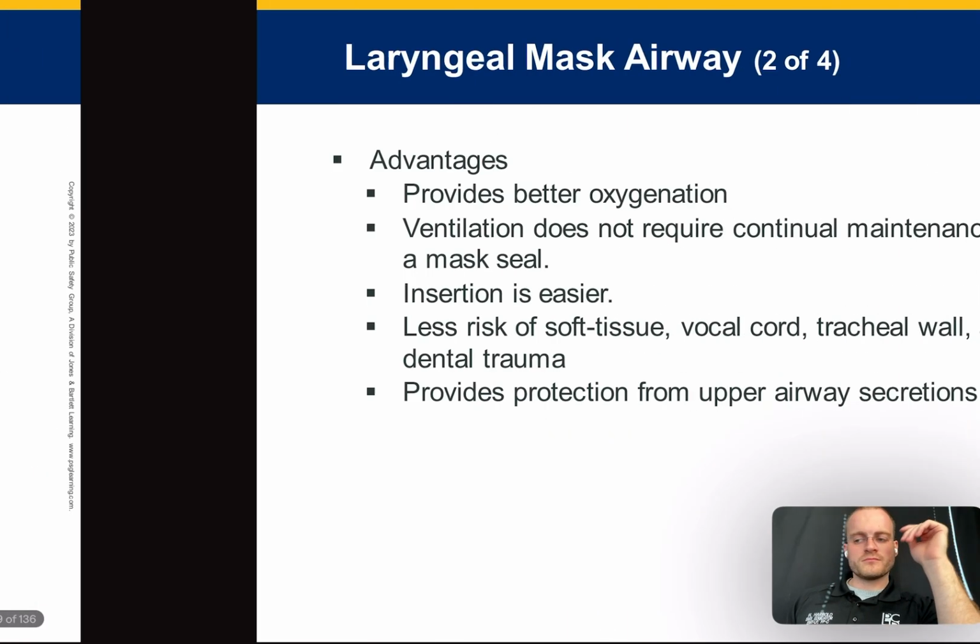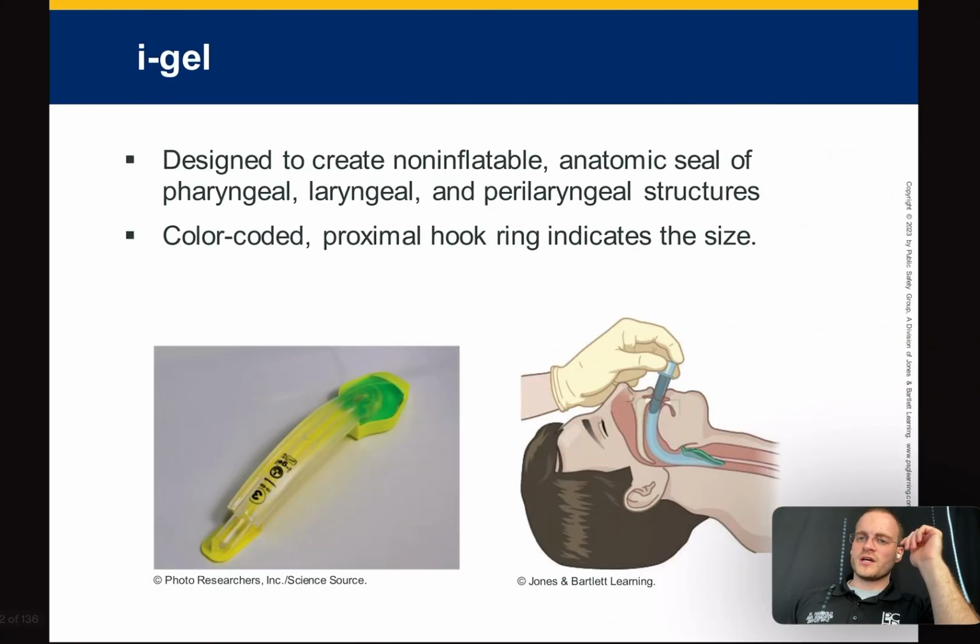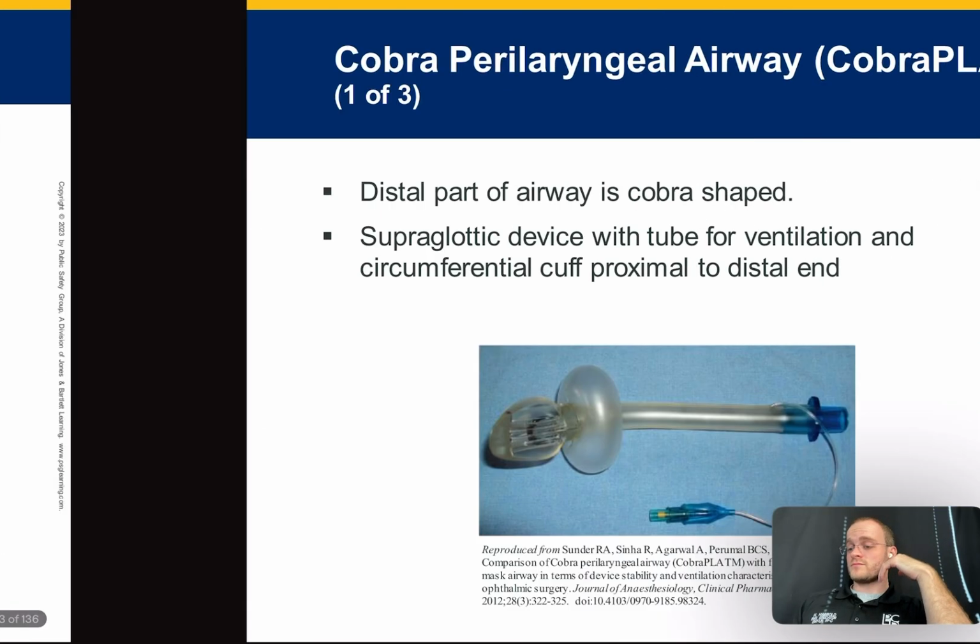It's just a different brand. Okay, we're almost done. iGel, this is what the Park County Hospital District's using right now. These are pretty good devices. These don't inflate, but they're different sizes. And so basically, again, it's a shove, shove, push procedure. You shove it in there. Hopefully it goes down the esophagus. You attach your BVM here, and it'll push air down into the airway, the trachea.